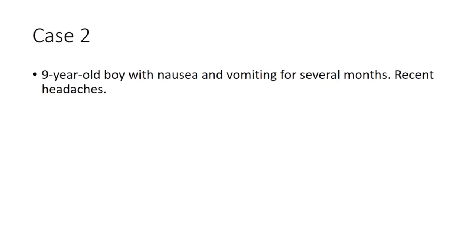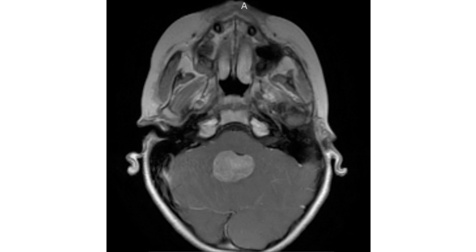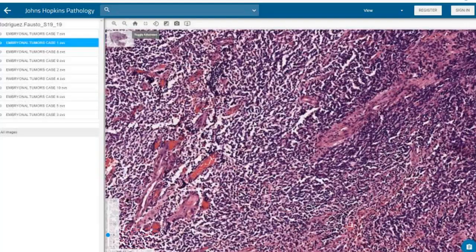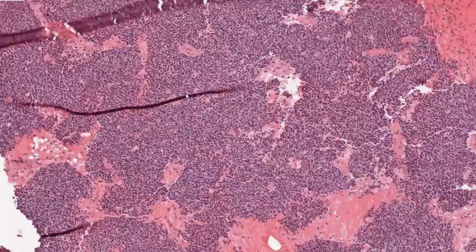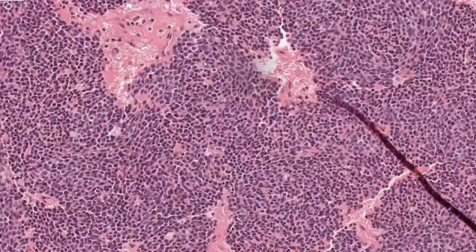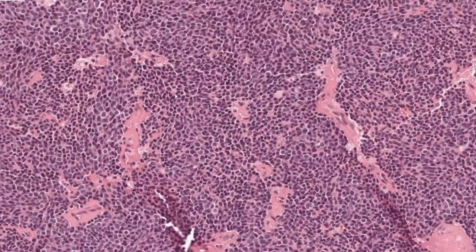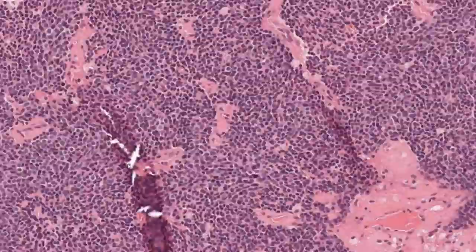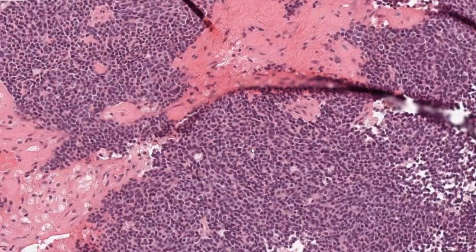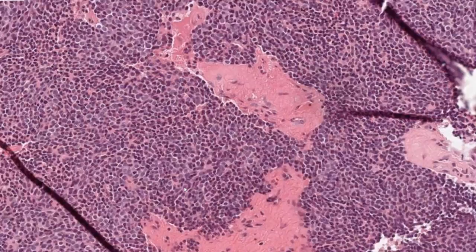Case number two: a nine-year-old boy with nausea and vomiting for several months and recent onset of headaches. MRI shows a contrast-enhancing mass filling the fourth ventricle. On high power, we are again dealing with a small round blue cell tumor in the posterior fossa of a young boy, making medulloblastoma the leading consideration. There is no significant nuclear enlargement, and a few cells have small nucleoli — nothing to suggest significant anaplasia. Some areas may represent neuronal differentiation.